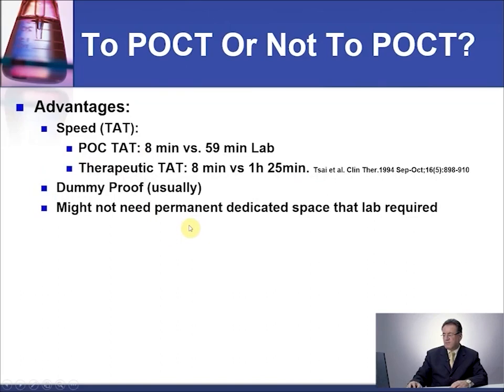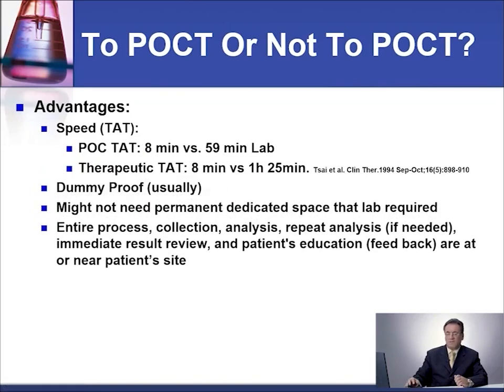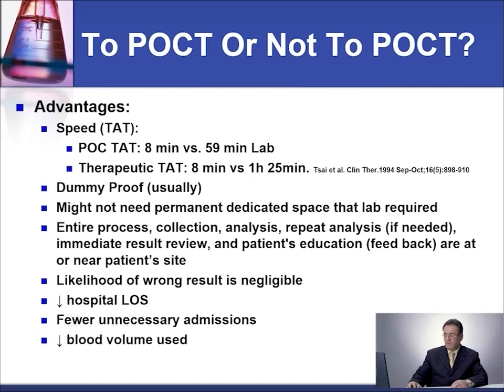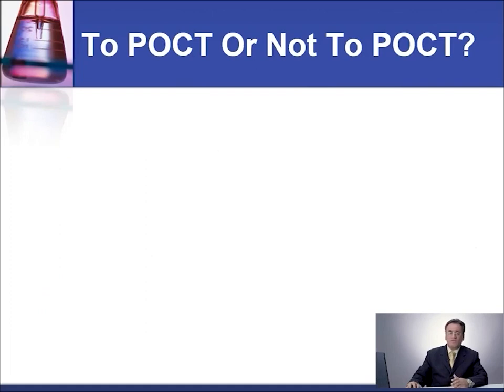Might not need the permanent dedicated space that the lab requires. You can carry it wherever you want, or if it needs a space, it will be a small space, okay? The entire process: collection, analysis, repeat analysis if needed, immediate result review, and patient education feedback are at or near the patient's site. Likelihood of a wrong result is minimal, or it's not going to be serious. Another advantage for point of care testing is reducing hospital length of stay. Also, fewer unnecessary admissions, reduced blood volume used. Okay, these are all advantages of point of care testing.